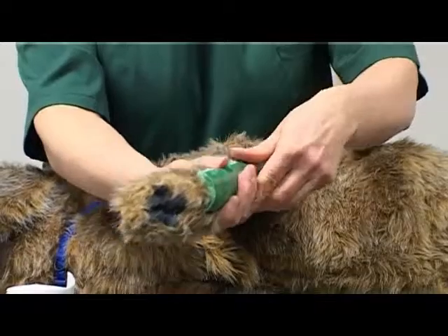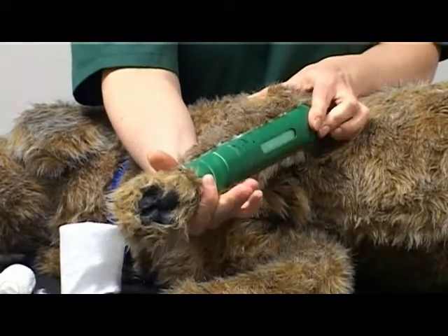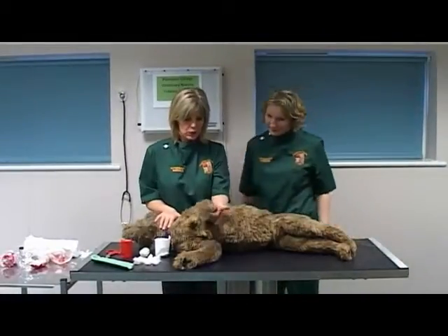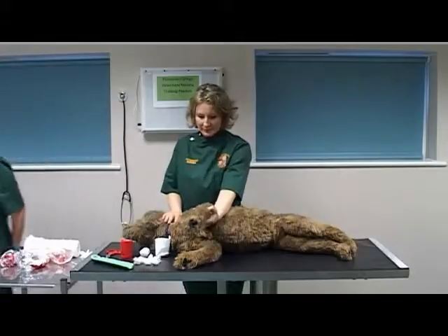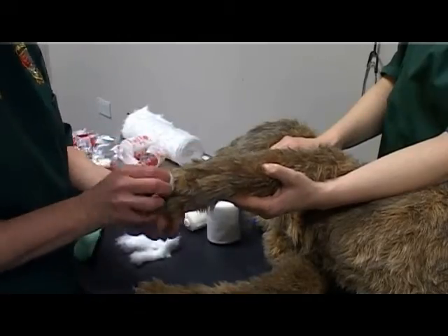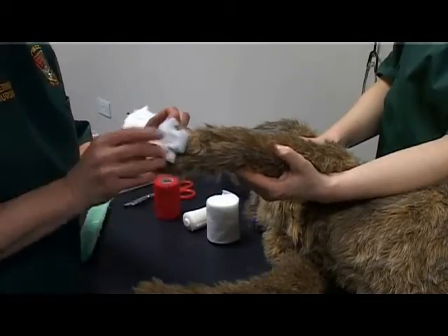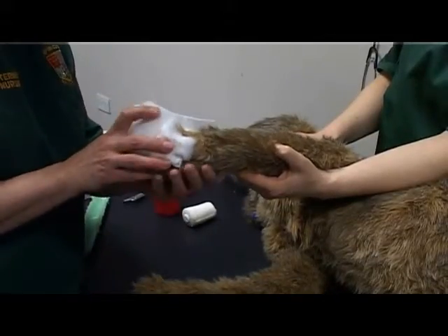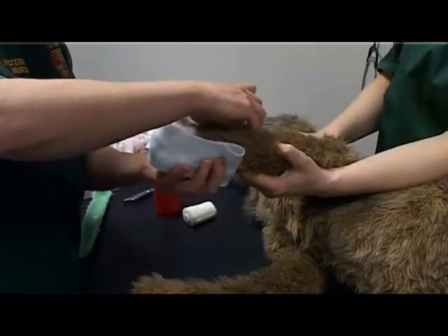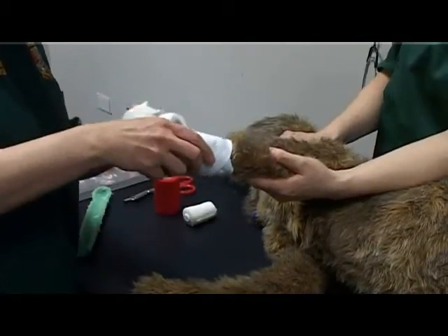The splint should incorporate the carpus and the elbow. Place the patient in lateral recumbency with the affected limb uppermost. Ask your assistant to support the affected limb to facilitate bandaging. Apply padding between the toes as far as possible on your model. Bandage distally to proximally and handle the limb gently.